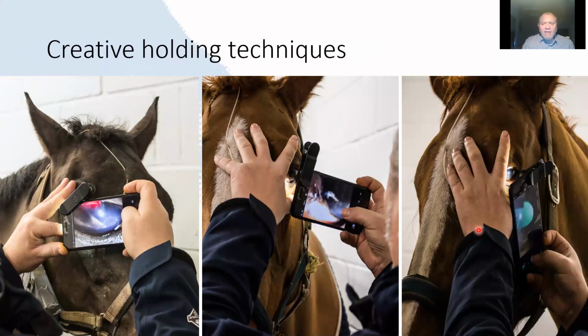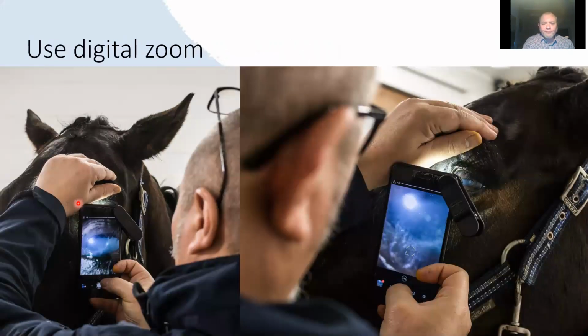In order to make these micro movements, you need to be able to support the phone. So you have to be a bit creative in how you hold your phone and how you position your lens on the phone itself. An important point is to rest your hands on the horse, rest your phone on your hand, and then that allows you to move backwards and forwards with very tiny movements to focus on exactly the right part of the eye. Once you've found the area of interest, you can then zoom in, as we are having in this right-hand image, to try and make sure that you're clearly in focus before you take the image.